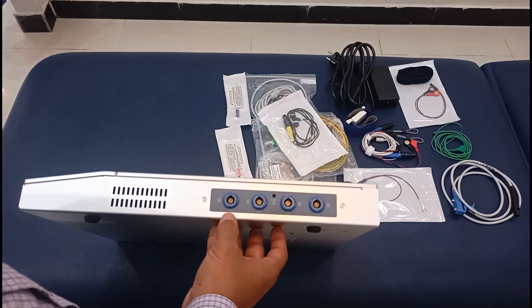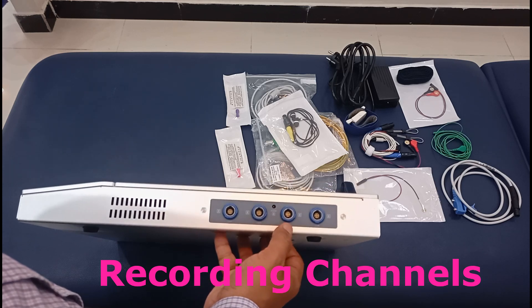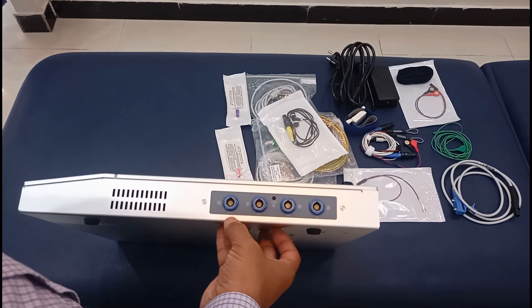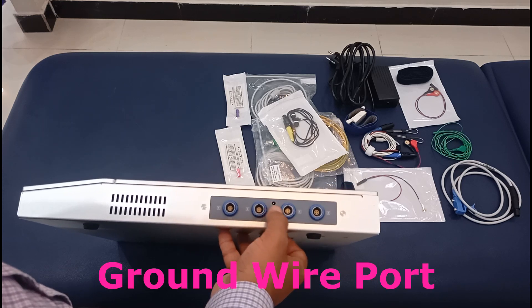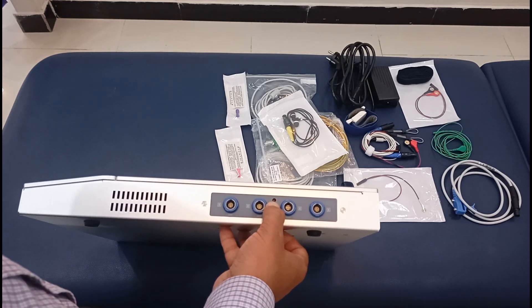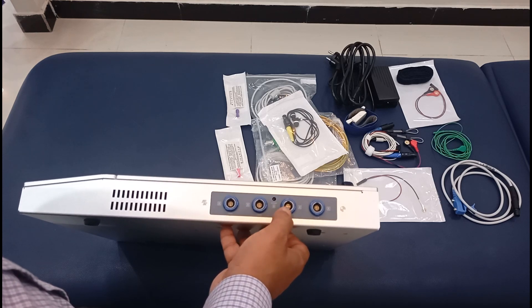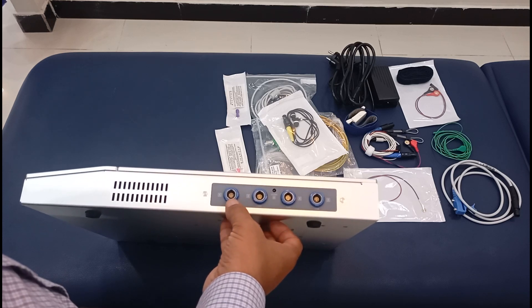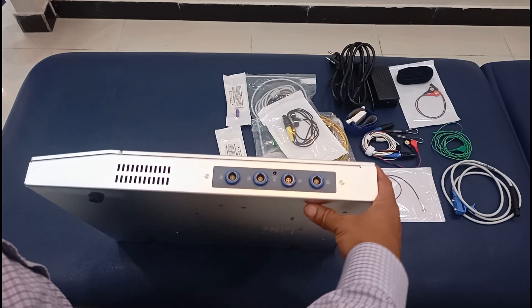Over here you can see channel one, channel two, channel three, and channel four. This is called a four-channel EMG/NCS machine or electrodiagnostic unit. This port is for ground — the small green wire goes to this ground port. These channels can be used for recording NCS and EMG, so these are the recording electrode channels.